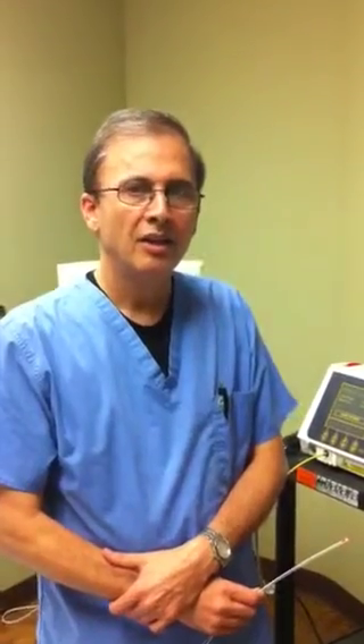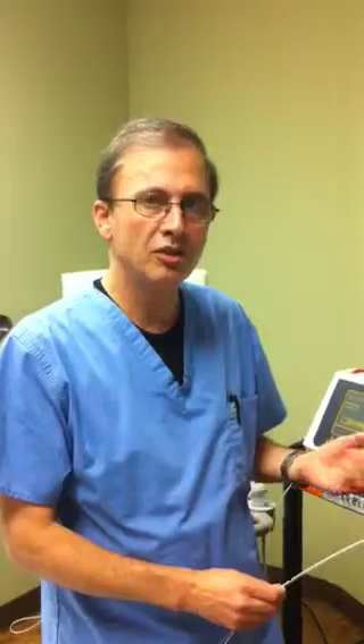This is Dr. Fattahi from Rains Specialty Medical Clinic, and I'd like to explain why we have changed and went to a different technology in delivering laser for ablation of the greater saphenous vein and short saphenous vein.